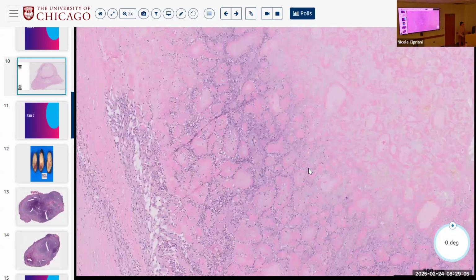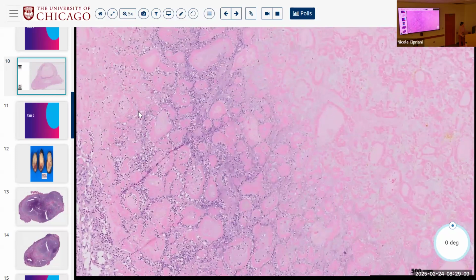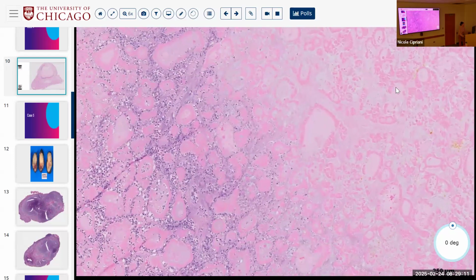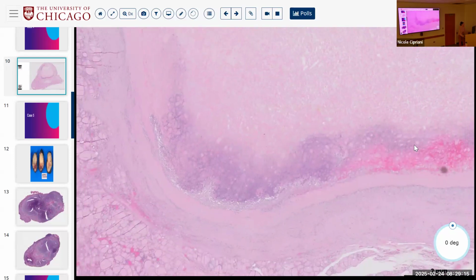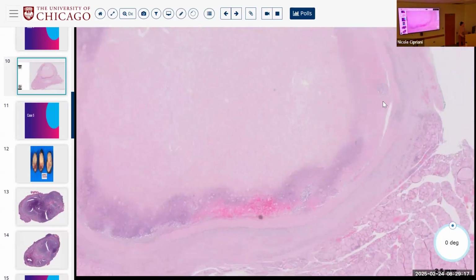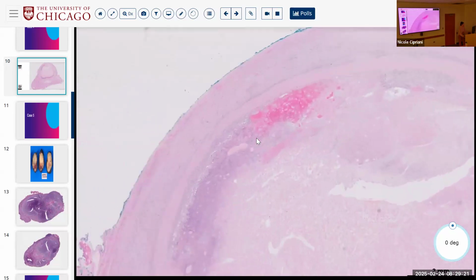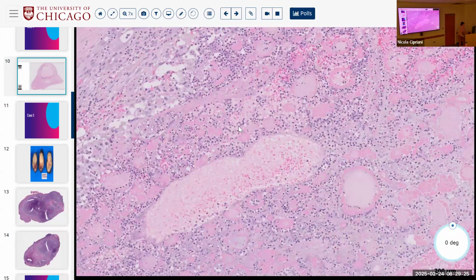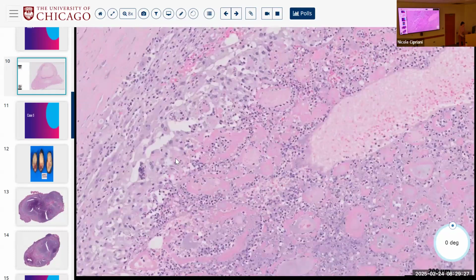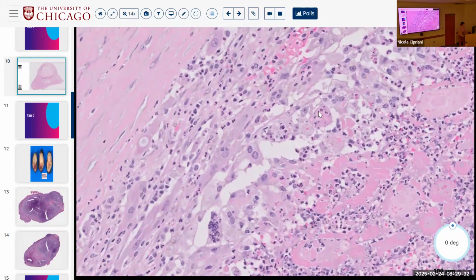It could also just be, I guess, dying. It could just be necrotic, looking at what this looks like. So I was kind of wondering, is this something that was treated before it was taken out? Or is this completely wrong, different? But the amount of inflammation makes me think it might have been treated, and especially how weird these guys look.